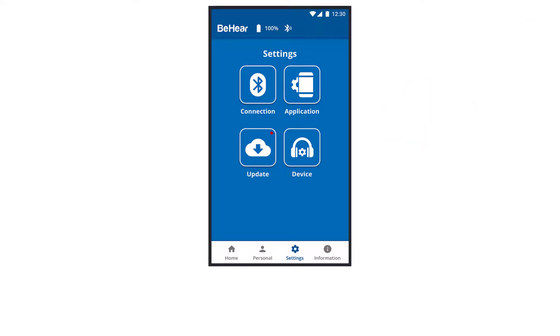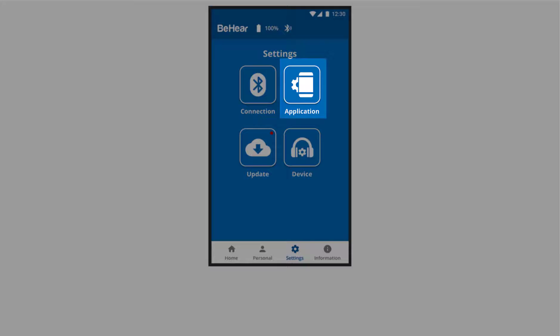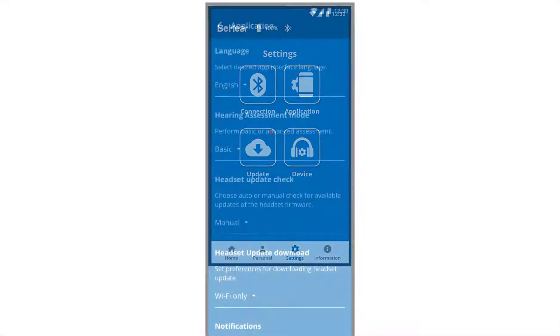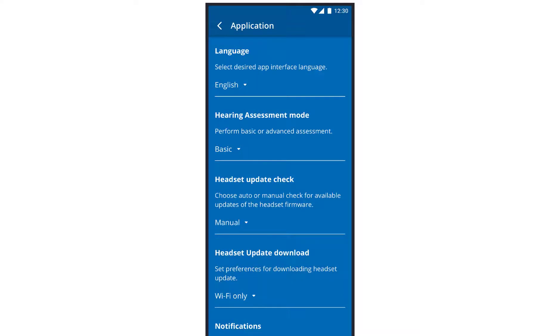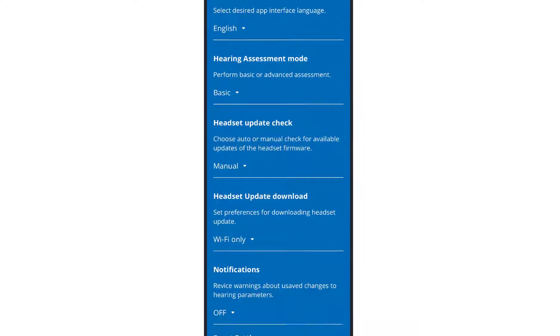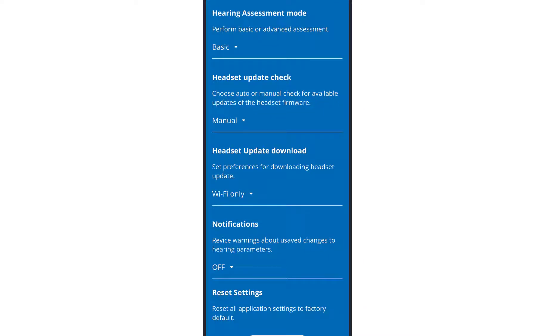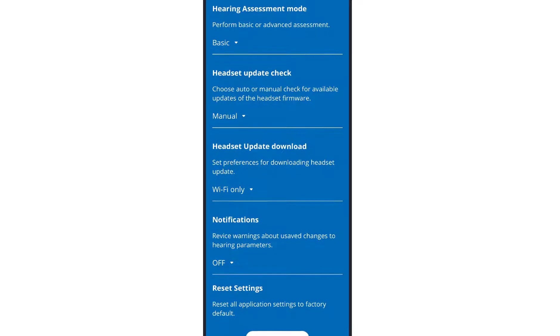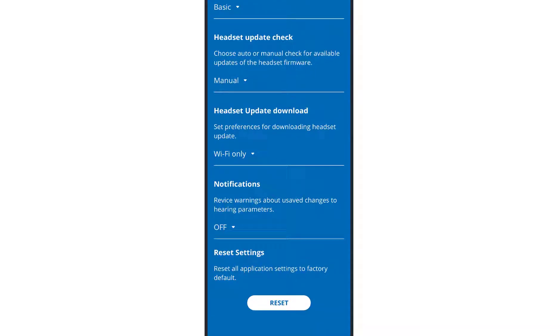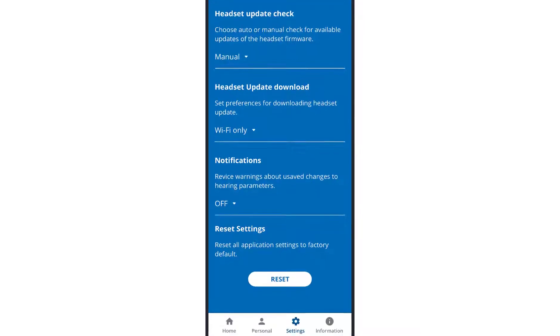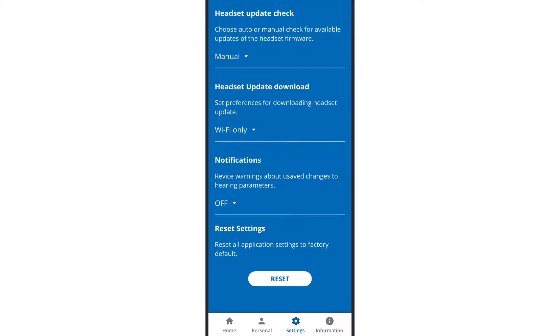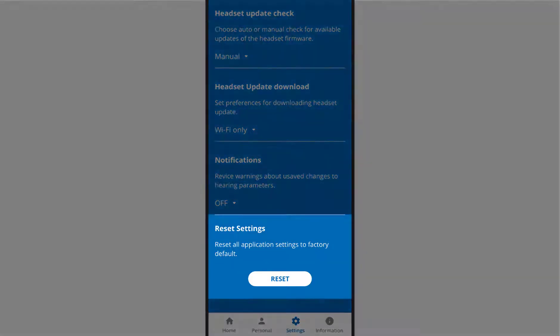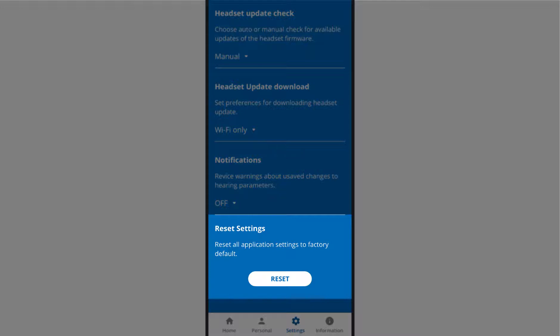The application section lets you determine your default preferences for interface language, basic or advanced hearing assessment mode, manual or automatic headset update checks, network type for downloading updates, and notification behavior. This is also the place to reset all application settings to their factory default.